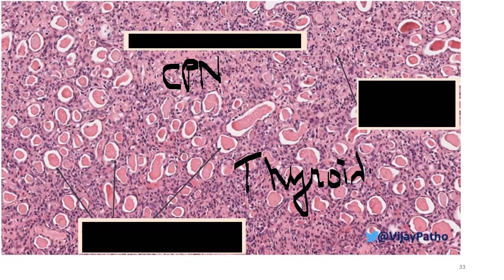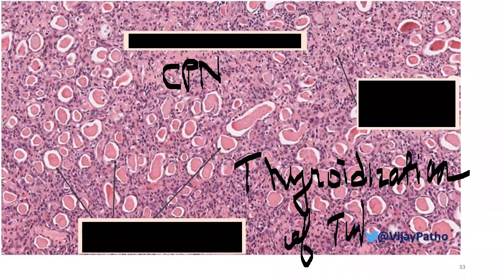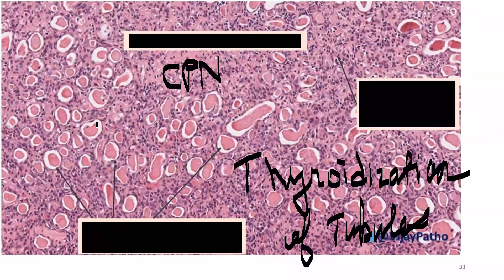This is a frequently asked slide showing chronic pyelonephritis (CPN). The characteristic finding is thyroidization of tubules — tubules filled with colloid-like casts resembling thyroid follicles. This is the condition of thyroidization of tubules seen in chronic pyelonephritis, and is an important spot diagnosis.